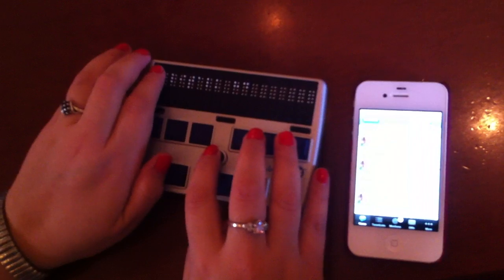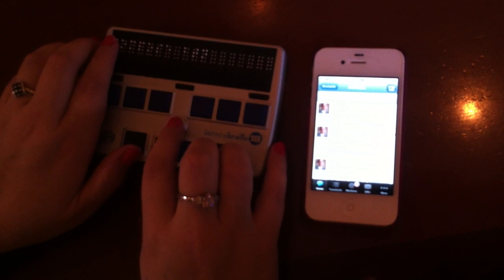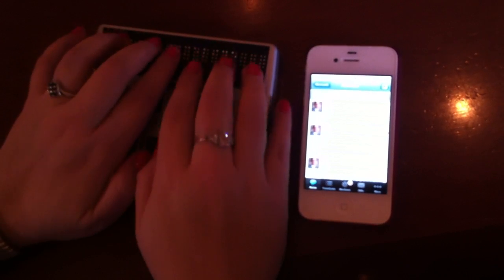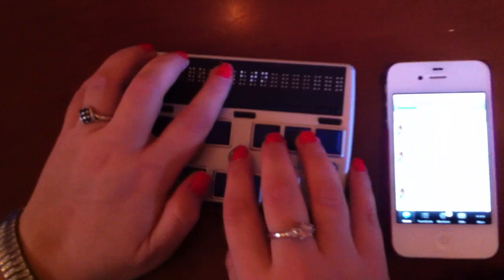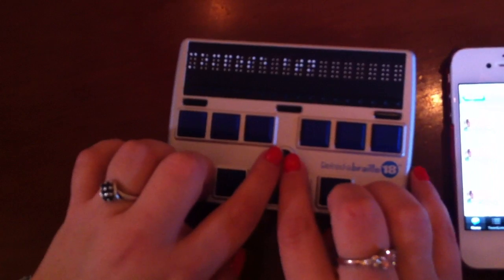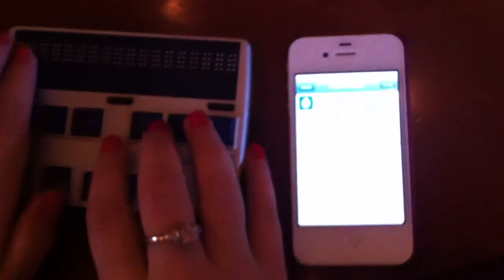I can actually turn the speech off if you want to. No, that's okay. Here's a compose button, so I'm going to press this little button here. It's like a joystick. I can move it to the right to move the display forward and read what's next, or I can move it to the left to go backward and read the previous thing I'm looking at. Okay. So, if I want to press this button, I'm going to press the button that I was just moving around. Text field. It says text field is editing, so. Okay.